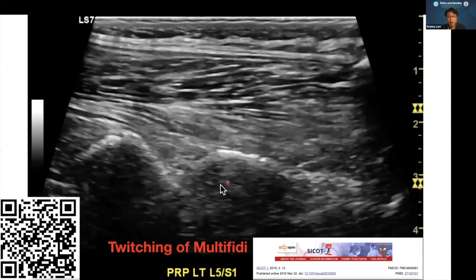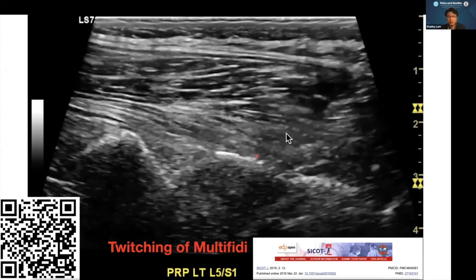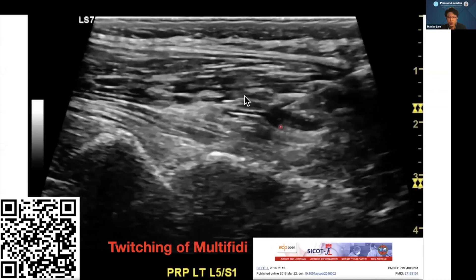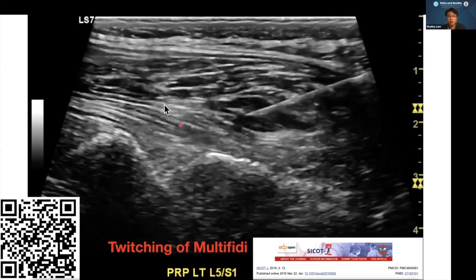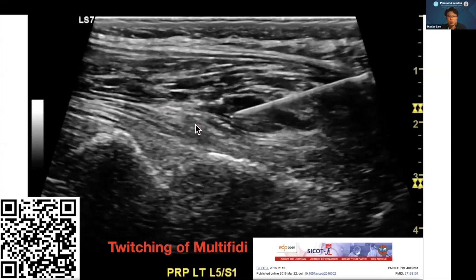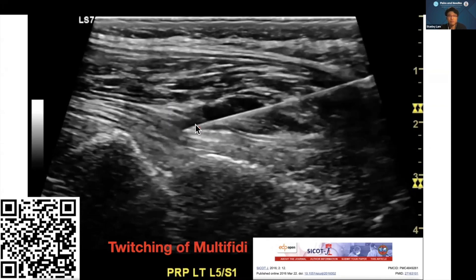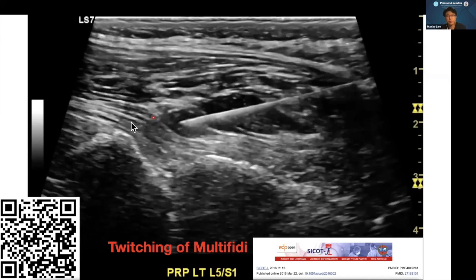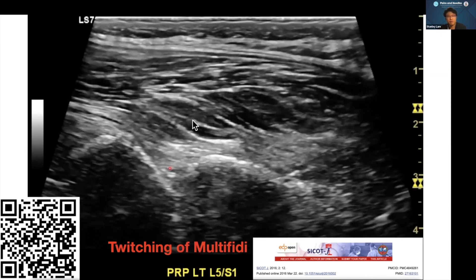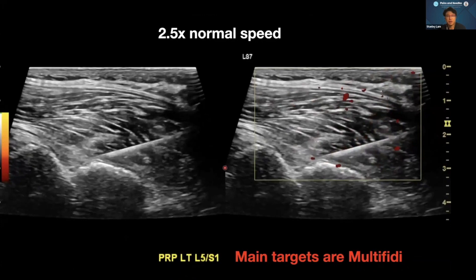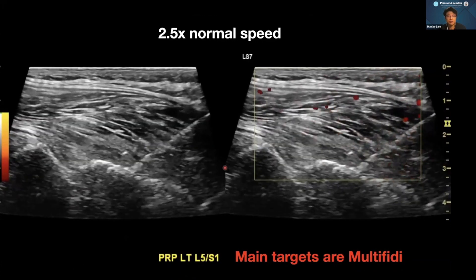During the injection, pay attention to the twitching of the multifidus. You can see multiple twitches — five twitches total. When I'm injecting into the striated pattern of this multifidus, the resistance is very small — this is in fact a fatty, atrophic multifidus pattern.